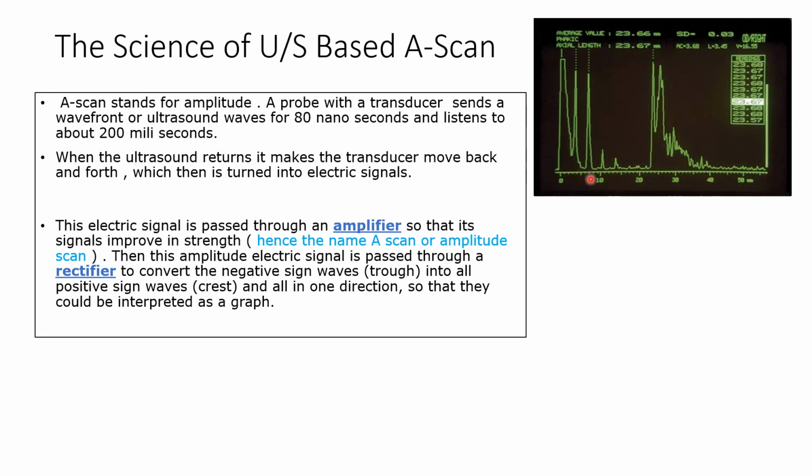So you can see these sine waves, and this basically helps us understand how well that measurement has been taken.